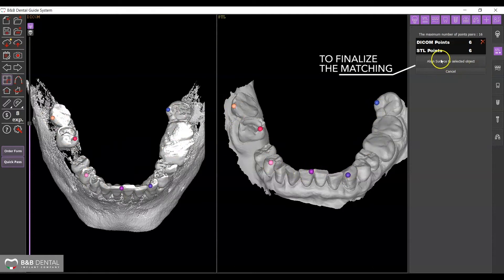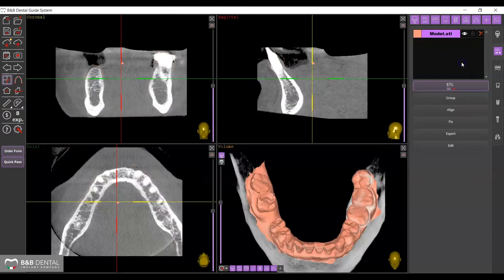Use the right panel to manage those points. Use the Align Surface to Selected Object button to finalize the matching.